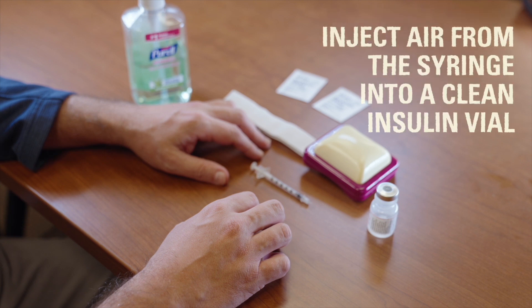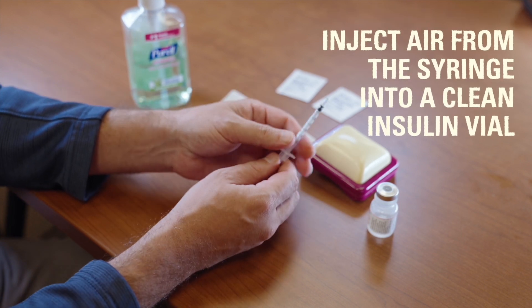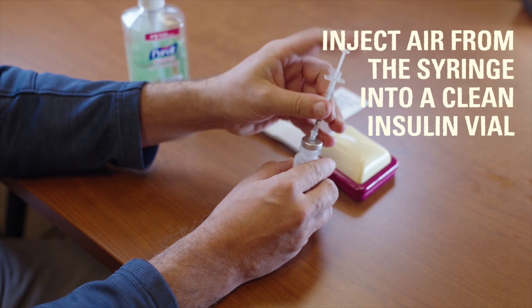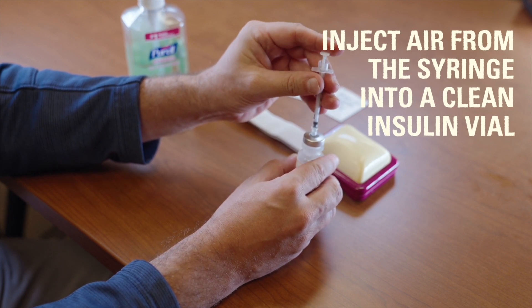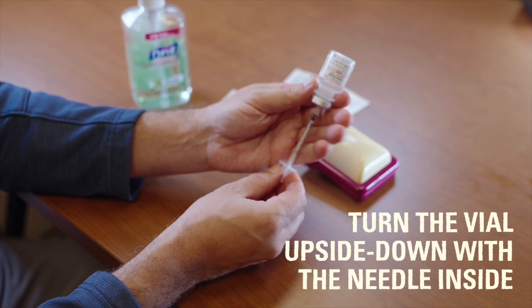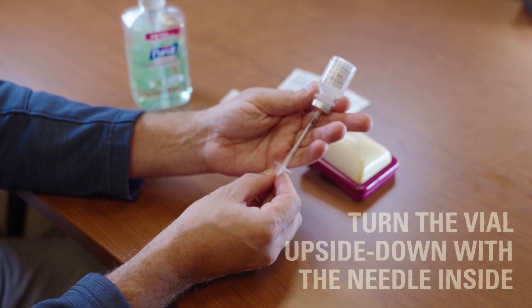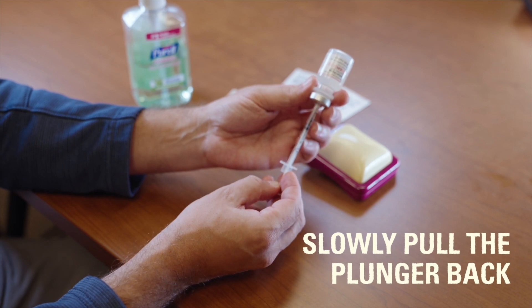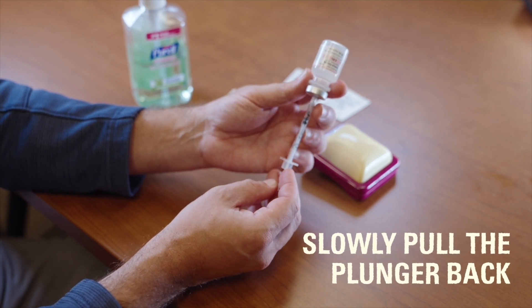To draw up the insulin with the syringe, first inject air from the syringe into the vial of insulin and leave the needle in the vial. Next, turn the vial upside down with the needle still inside. Slowly pull the plunger of the syringe back and watch carefully as the insulin is withdrawn into the syringe.